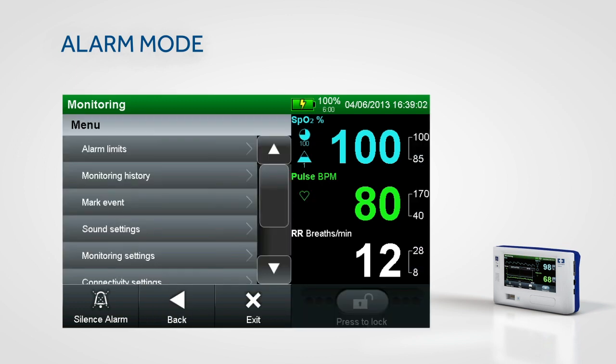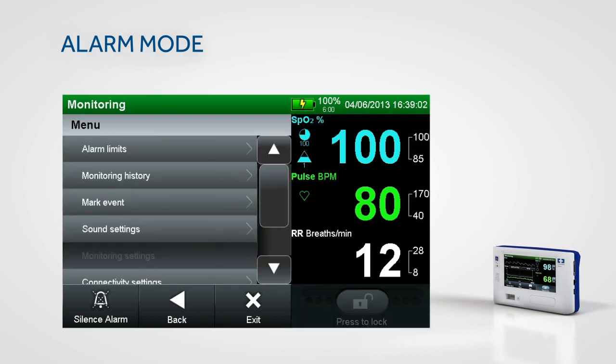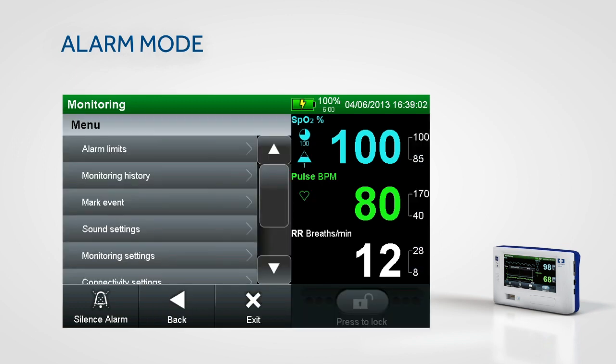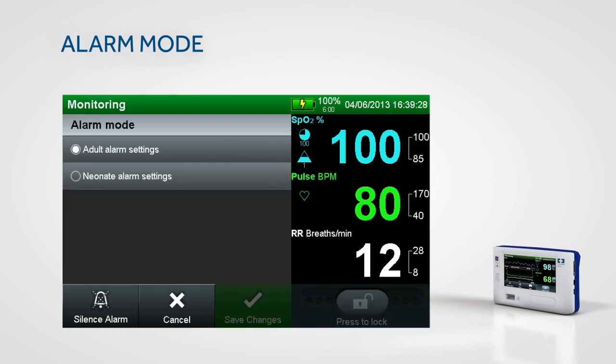To access alarm mode, touch menu and select the monitoring settings submenu. From this menu, you can choose settings for adult or neonatal patients.